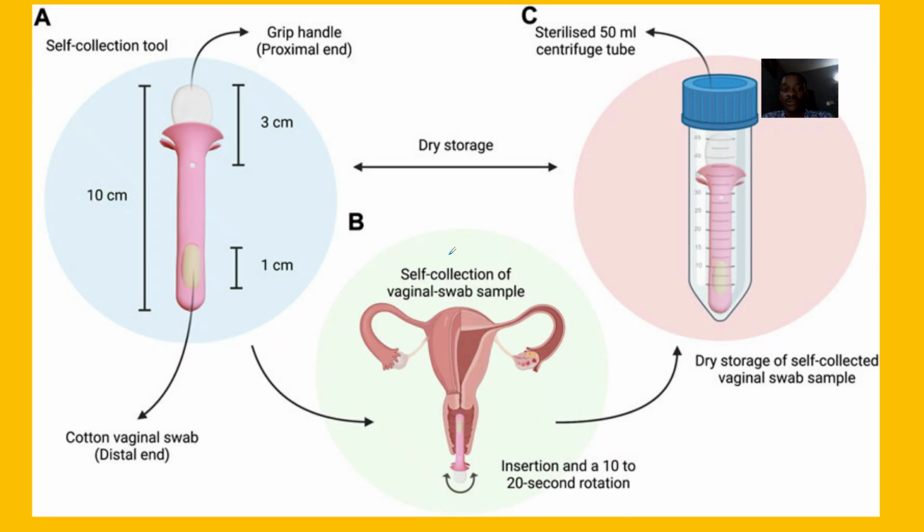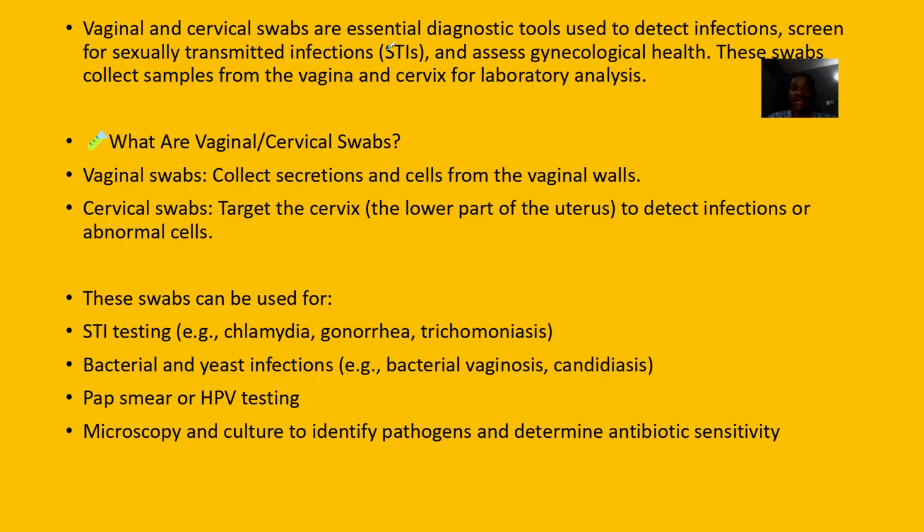So let's quickly look at them, and basically their applications, so to say. They are very important diagnostic tools. They help you to detect infections, screen for sexually transmitted infections, and also just assess the general sexual health of the individual.